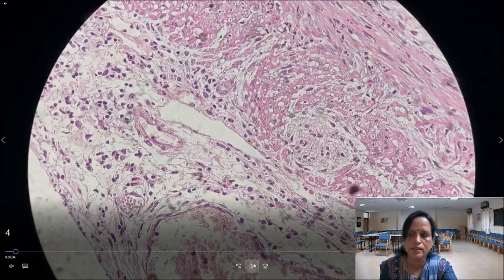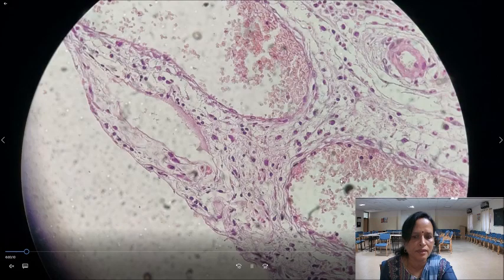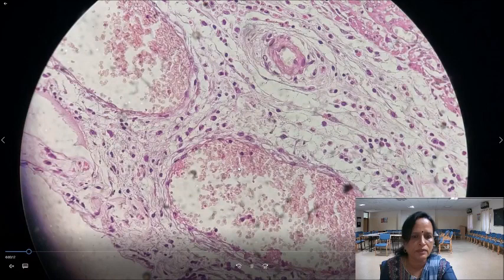Okay, the congested blood vessel. See, so much dilated and congested blood vessel. Edema here. See, such prominent. They would be seen very well on the serosa. See, look at inflammatory cells. Yeah, this we saw. We are seeing it again.